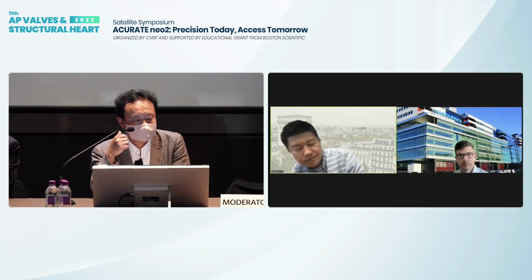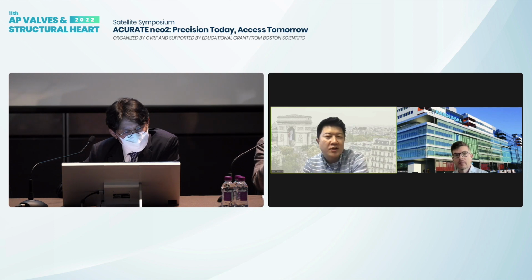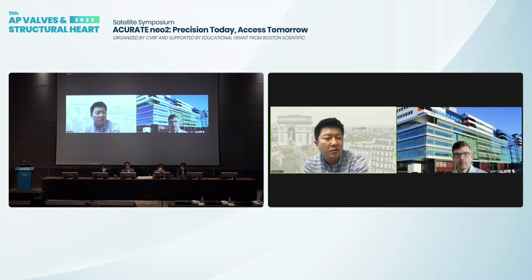Yeah, maybe I can add. I've shown you in the first presentation, there are a lot of beneficial features of the ACURATE Neo. I think it has a comparable hemodynamic profile. Gradients are very low, which I think is important for long-term durability, but at the same time it has a very low risk of coronary obstruction. And I think this might be very important in the Asian population. I was in Bangkok last week, and this might not be that different in Korea or Japan. The patients are much smaller than in Europe, and coronary distances are very small.